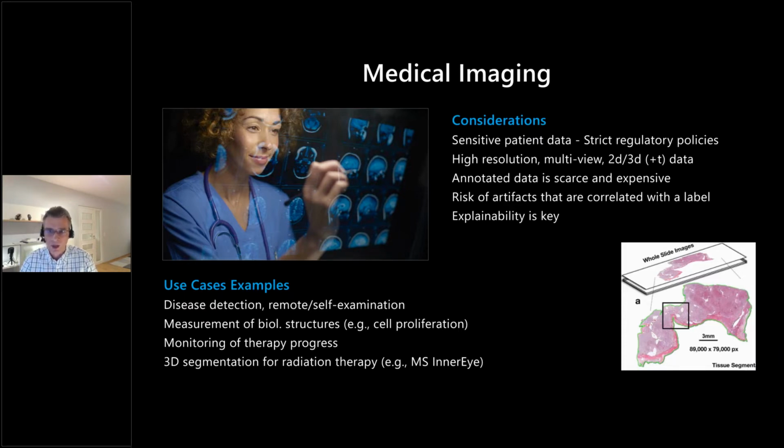So there might be a correlation which the AI algorithm can pick up during training. And for example, there can be this misconception that a blurry image is likely to be associated with pneumonia. So modern ML algorithms tend to exploit these kinds of shortcuts instead of learning the real underlying visual patterns of the disease. Therefore, explainability is really key to understand what made the algorithm come to the specific prediction. So did it really learn the underlying pattern of a disease, or did it just take up any correlated distractors? I think that's very important.